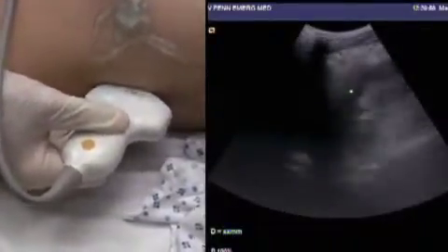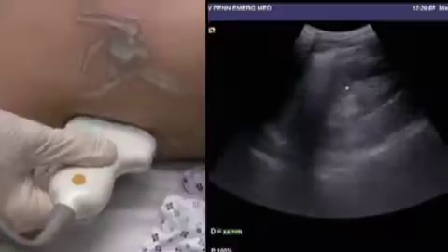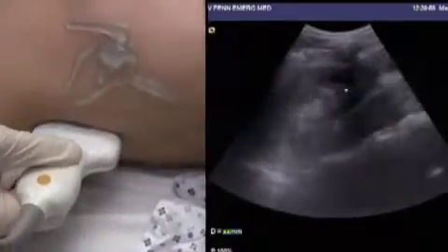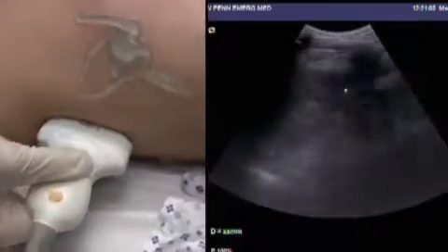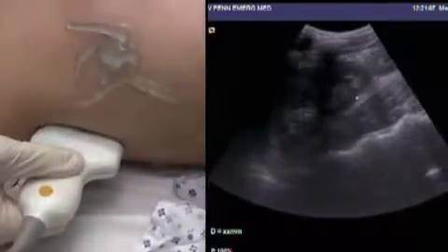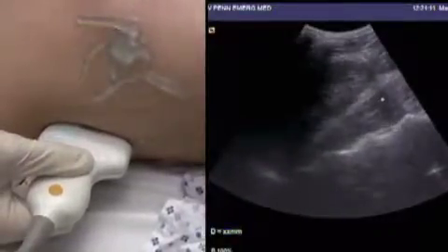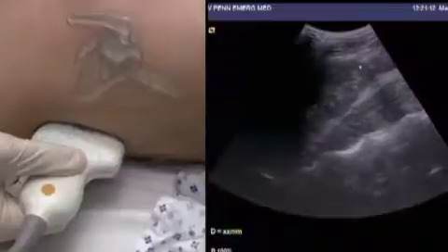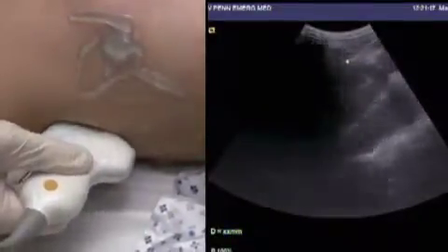In the case that you do a FAST exam which is limited by some technical consideration like this, you should bear it in mind and include it in your report. If you truly can't make a fully negative exam, you should just mention the limitations that you encountered. The inferior pole of the kidney is seen right here on the screen, sliding up and down over the psoas muscle. This psoas muscle is normal. You'll be looking right in here, in this potential space, for free fluid.